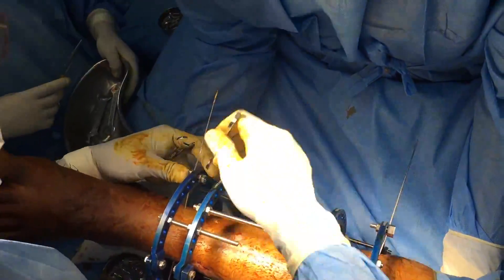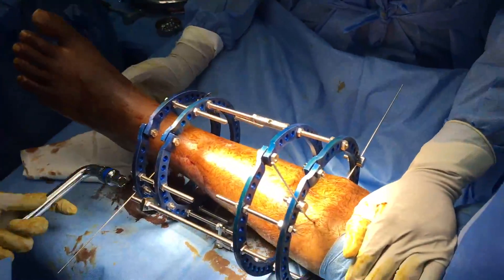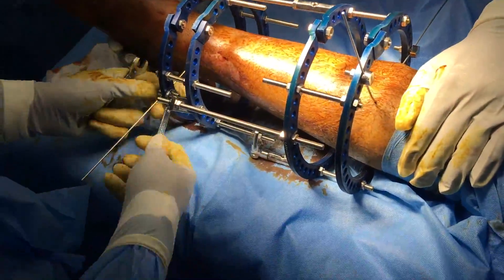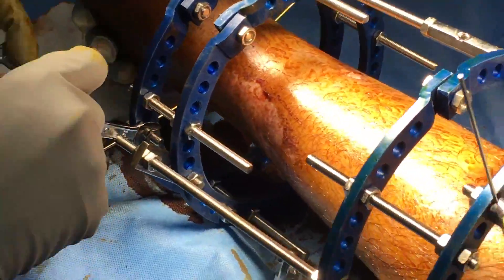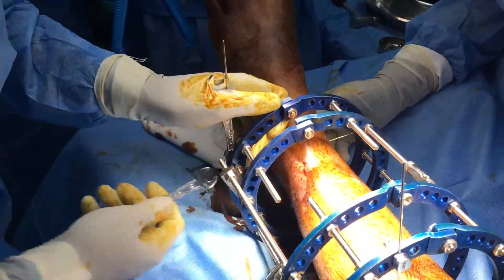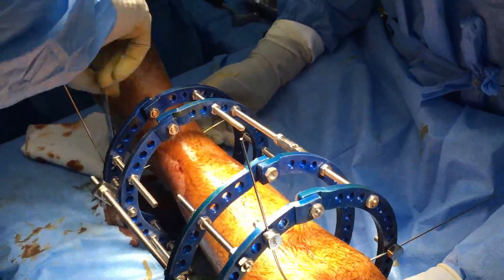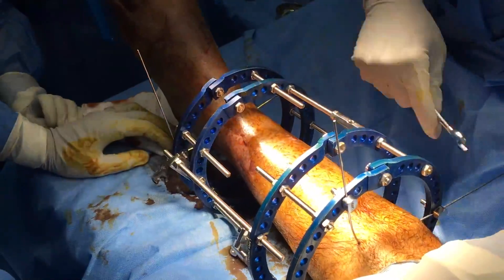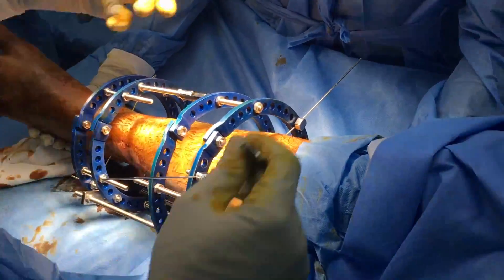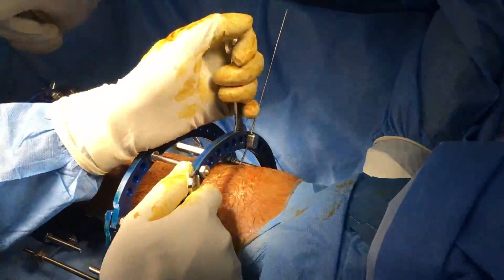One end of the wire is tightened, cut, trimmed and twisted. The opposite end is now tensioned by the Russian method, which involves twisting of the nut by about 90 degrees. The resonation difference between un-tensioned and tensioned wires tells us that the distal wire has been tensioned.